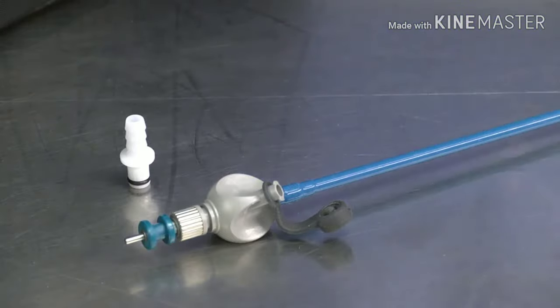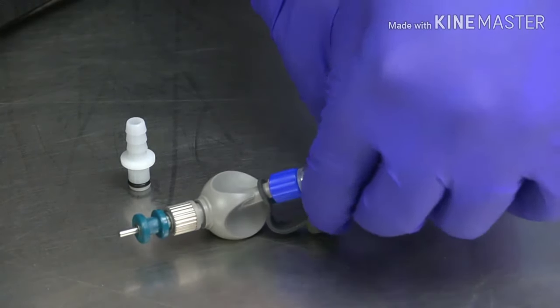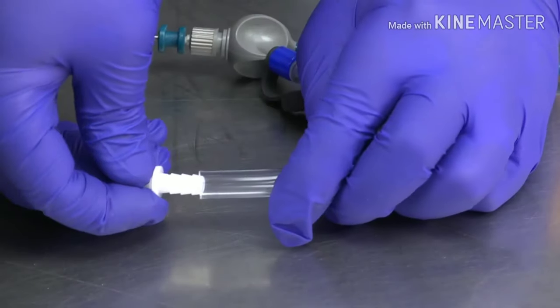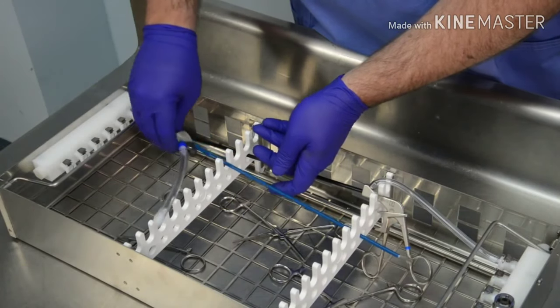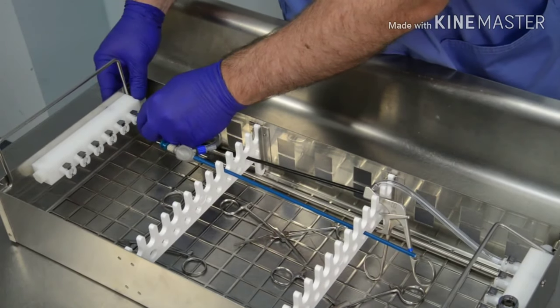Instruments with male lure ports can be connected by attaching one end of a 4mm hose with a lure lock to the instrument port, and inserting a 4mm nozzle into the other end. Place the instrument with the open tip into an empty slot in the organizer and connect the hose nozzle to the flush port on the basket manifold.